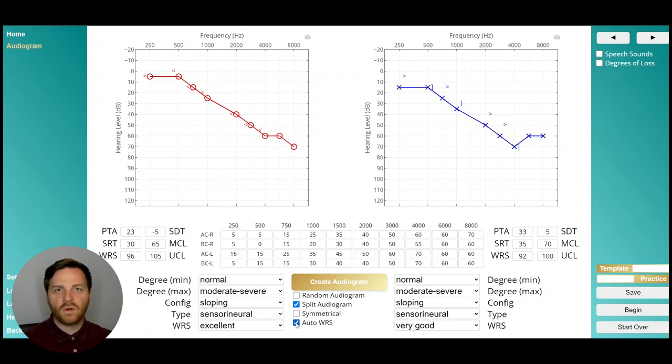AutoWRS attempts to estimate the word recognition score that best matches the audiogram that you've designed. Sometimes your word recognition score won't align with your thresholds, so if you want to manually set your word recognition thresholds, you'll need to uncheck AutoWRS and then choose the WRS score that you want for that specific case in your design.